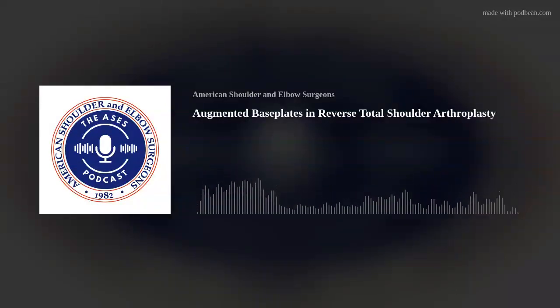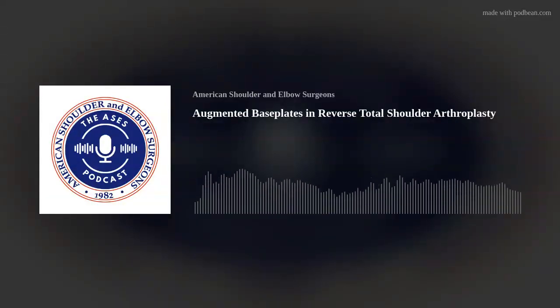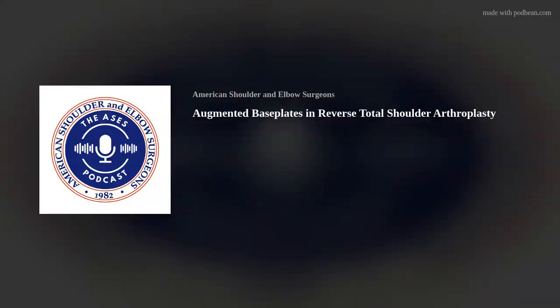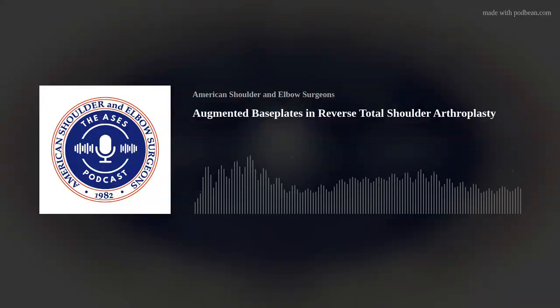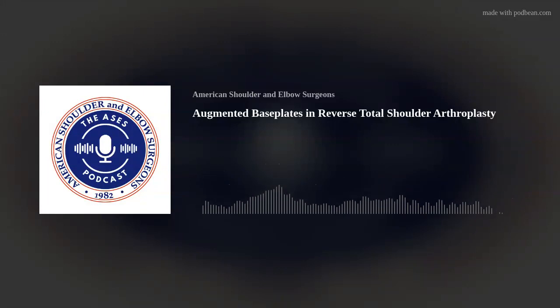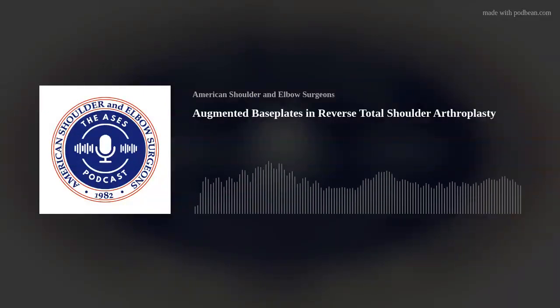I pack it either with, depending on the size, cancellous graft, and you can really pack it deep and get it pretty dense, or I'll use femoral head that I shape, and I get fixation on the far cortex. And I would say the vast majority of the time I feel comfortable doing that in one stage, and that's done well. I've had failures, but that's generally the way that I approach that.